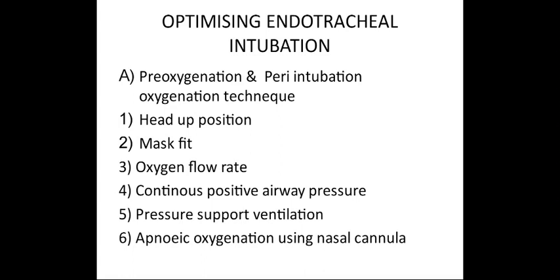Fourth, continuous positive airway pressure. Application of continuous positive airway pressure of 5 to 10 cm of water during pre-oxygenation is recommended if not contraindicated. Fifth, pressure support ventilation.